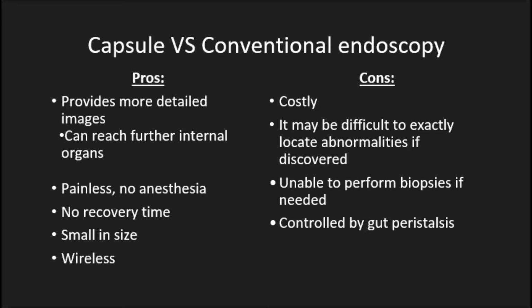However, patients with implanted electromagnetic devices cannot utilize this tool because it can disturb these devices, causing delays in programming or recalibration. Thus, the conventional method is preferred for patients with electromagnetic devices.